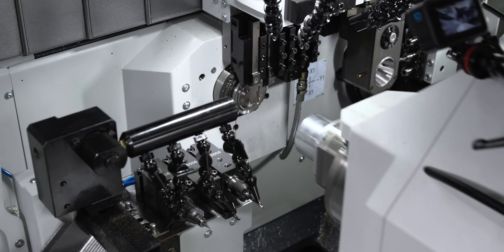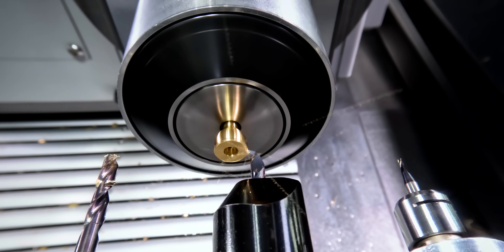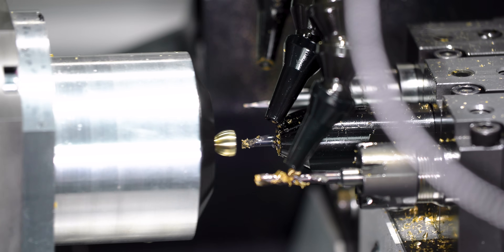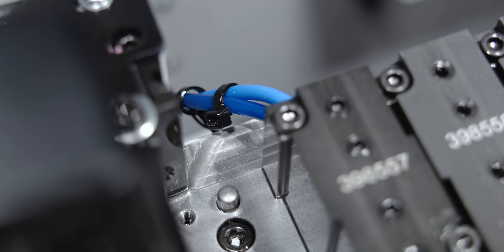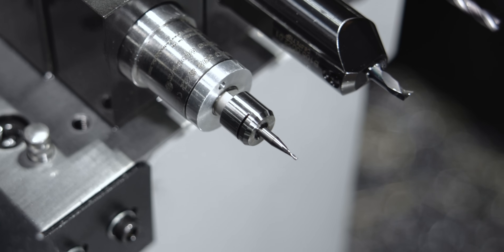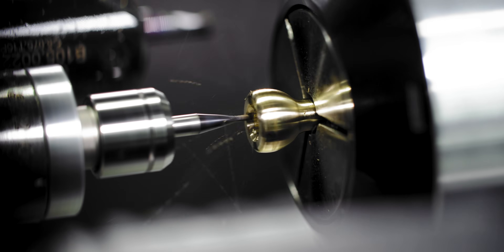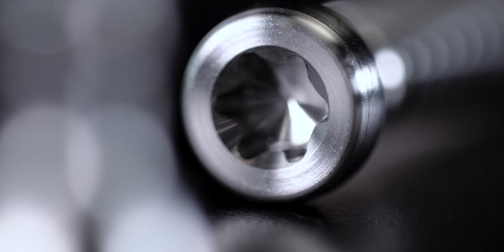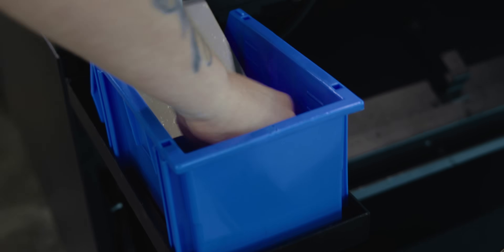After that, it's pretty simple — I just cut off and transfer over to the sub-spindle. The first thing I do is drill for the hexalobe, face off the part, put the radius on there, and then chamfer the hole for the hexalobe. Then we mill the hexalobe with a one-millimeter end mill, which is super tiny, but using a high-frequency air spindle made it really easy — at 80,000 RPM I have almost no tool pressure. It allowed me to go 20 inches a minute, and this thing was flying through that hexalobe. After that, the part ejects through the tray, and there you have it — bone screws.